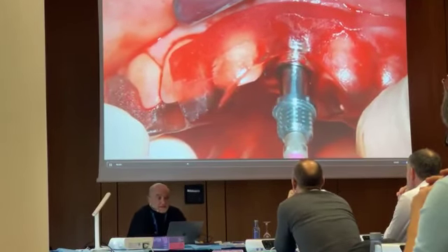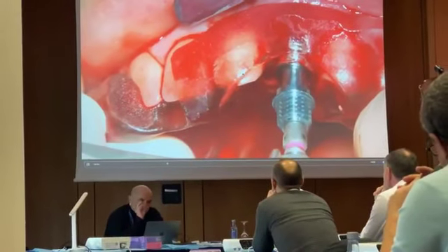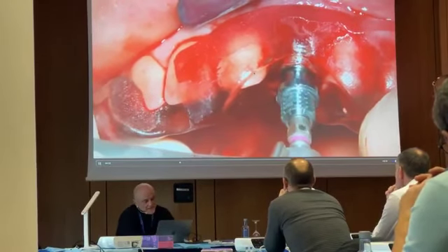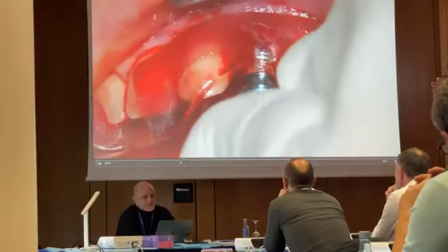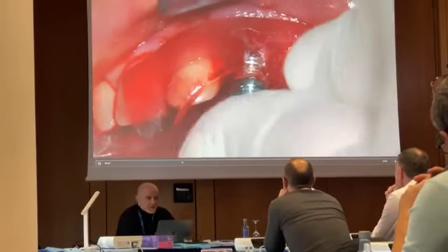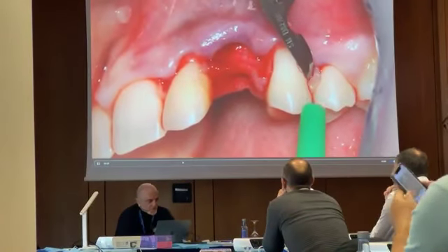Fully guided means that it's much better also that the implant is guided, so we are absolutely sure to place the implant where it was planned. And the proof of the pudding is when you try the temporary crown, that is already very precise with respect to the implant placement. I like to feel in my hands the last 2 millimeters, so I know that there is primary stability enough for the immediate temporization.